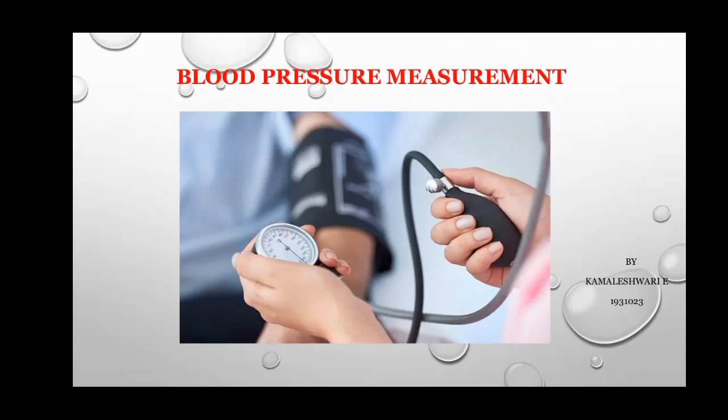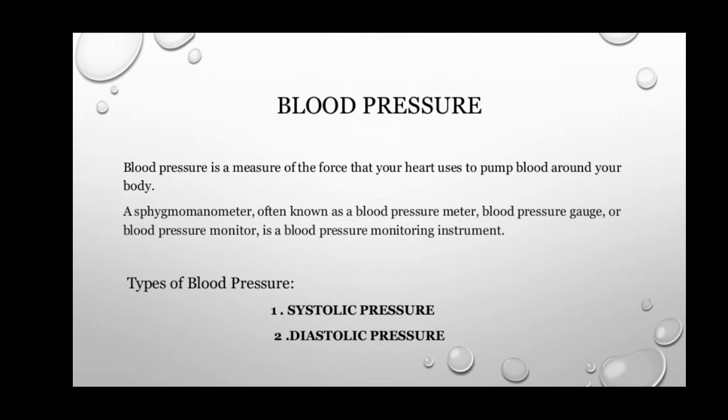Hello everyone, now I am going to present my topic about blood pressure measurement. Blood pressure is a measure of the force that your heart uses to pump blood around your body. Sphygmomanometer is the instrument which is used for monitoring the blood pressure.